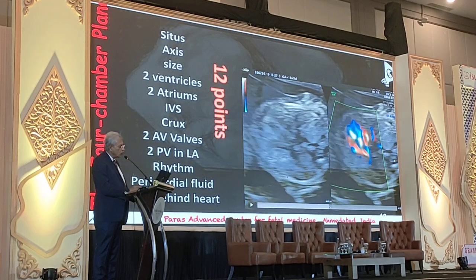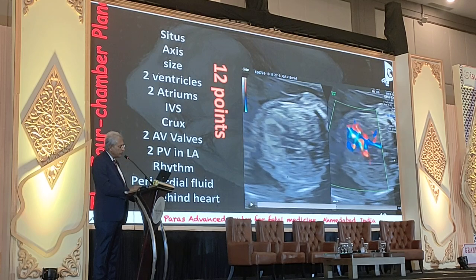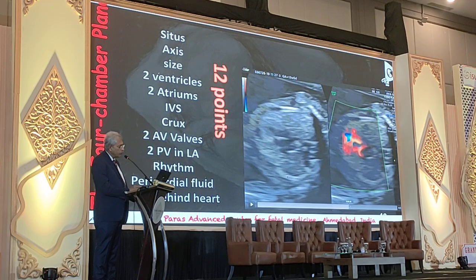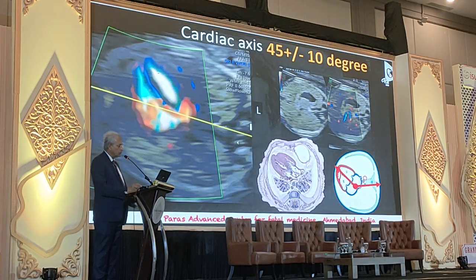You just go on doing interventricular septum. This is LVOT which is coming out, going towards the right shoulder. You see the pulmonary artery bifurcation where it bifurcates into 1 and 2. Then you still go up, you see 3 vessel view. You still go up, you find 3 vessel trachea view. You will see everything. This is exactly what I want you to understand, that there is nothing specialized system in this, but only thing you need to have is high resolution.